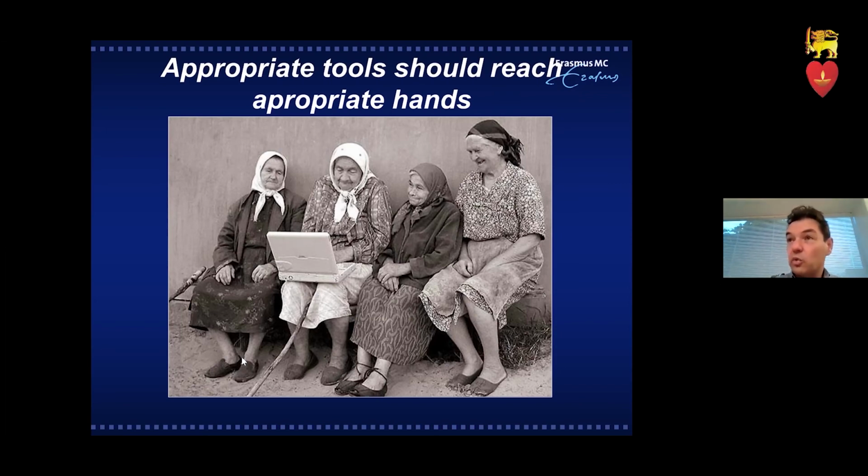Also, what you could do is a post-stenting FFR. So if you think you see some tapering, you have TIMI 3 flow, normal, no chest pain, etc., you can change your provisional strategy to a two-stent strategy, a TAP like that, if you still have a positive FFR in completing your left main procedure.